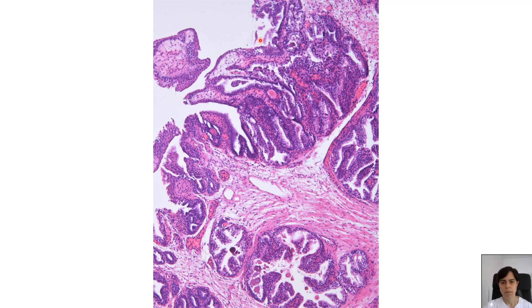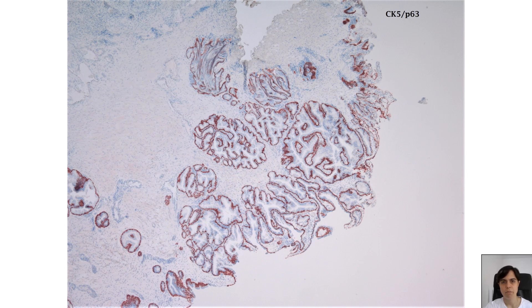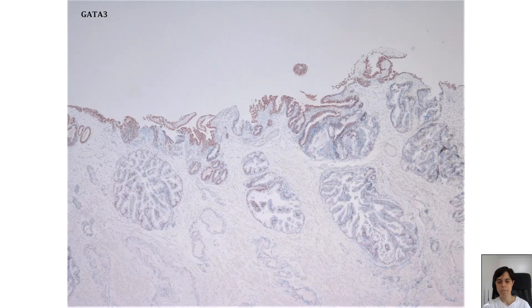Benign prostatic epithelium lining delicate papillary projections with true fibrovascular cores. On stains: PSA beautifully highlights the luminal cells of the prostatic epithelium. A combination of CK5 and p63 labels the retained basal cell layer in a continuous fashion, highlighting the benign nature of the prostatic epithelium. AMACR is negative again. GATA-3 shows, in this example, a bit more intermixed urothelium with the benign prostatic epithelium.